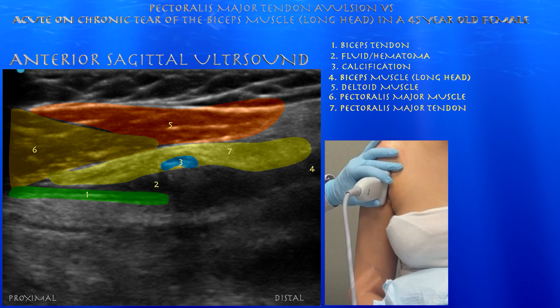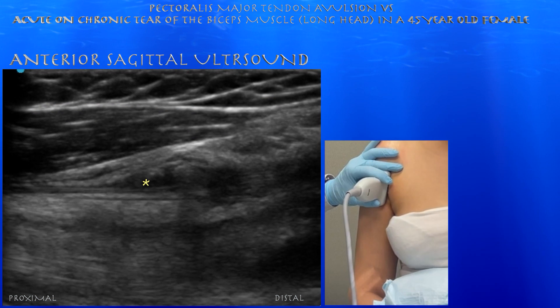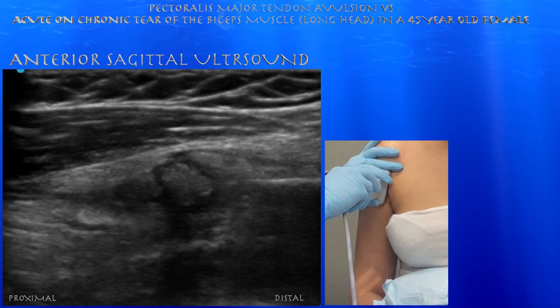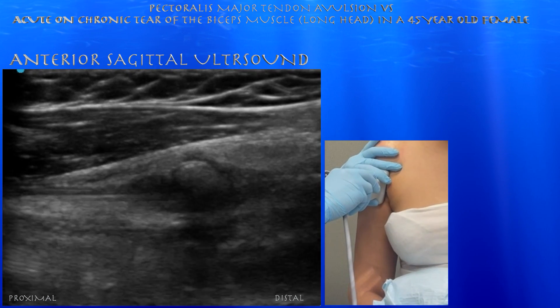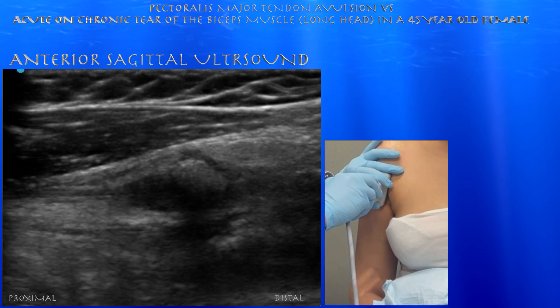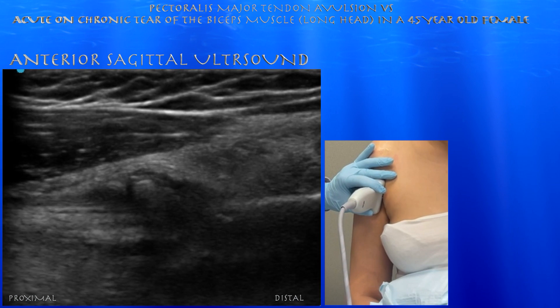Here you can see the long axis view of the biceps tendon, and you can see this calcification. It looks like it's in the long head of the biceps muscle, but actually it's in the tendon of the pectoralis major muscle. It could be just an avulsion from the humeral shaft, perhaps.